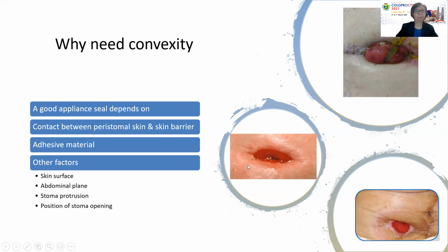On top of that, the stoma opening position is also not ideal because it is actually pointing to the skin level. So you can imagine the difficulty to manage this patient. Sometimes the stoma opening is facing the top of the skin. It is not below. It is also another type of case that is more difficult to manage.